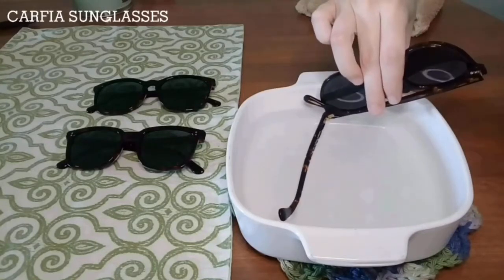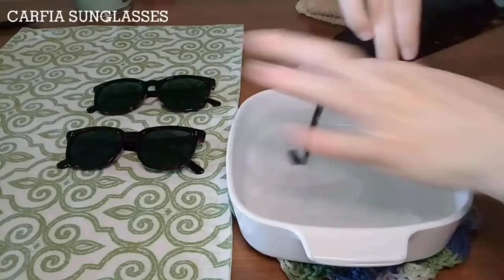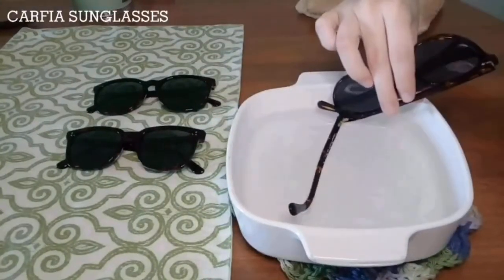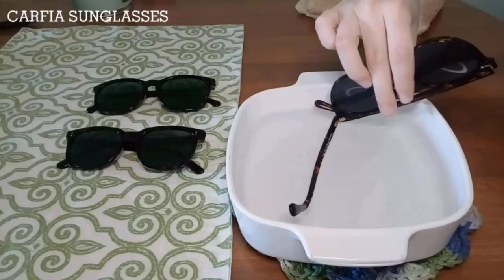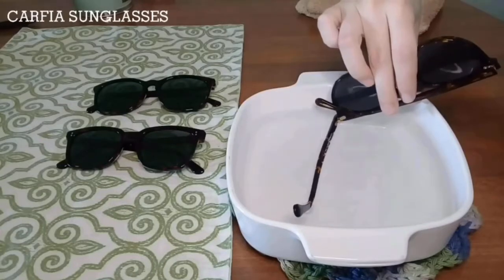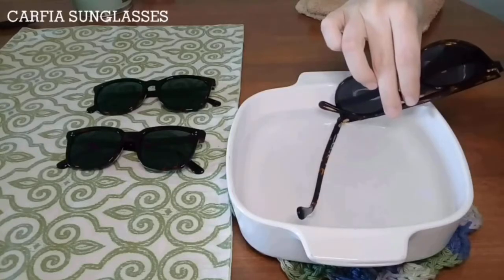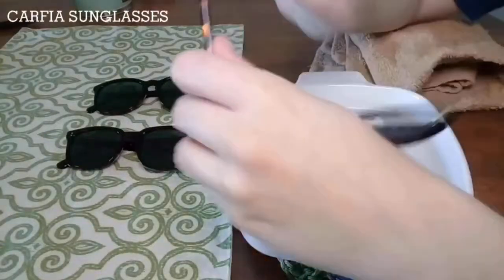So I'm going to leave this in for about 15 to 30 seconds, just depending on how hot your water is. You can take it out and kind of gauge how hot it's getting. If you feel like it's heated mostly throughout, then you can stop. For me, I'm going to leave this in for a couple more seconds just to make sure I'm really achieving the level of heat that we need for this to be successful. So now I'm going to just dry that off a little bit.